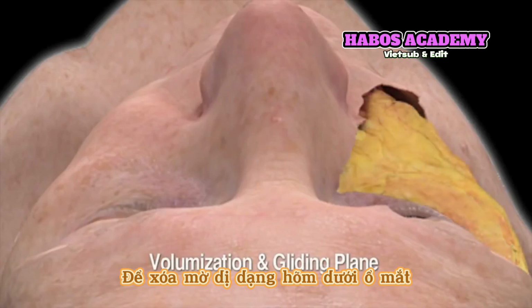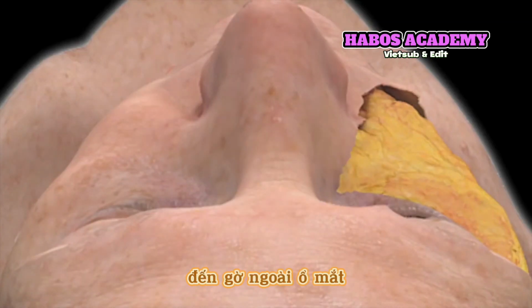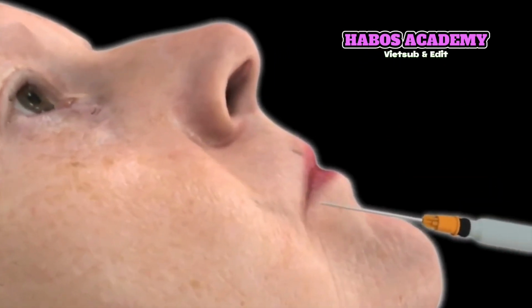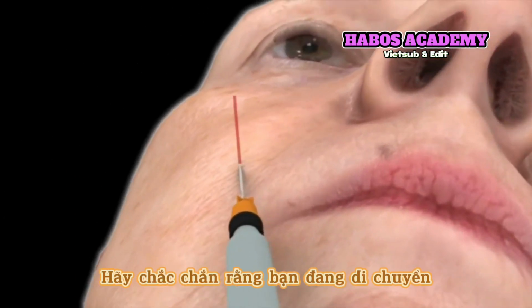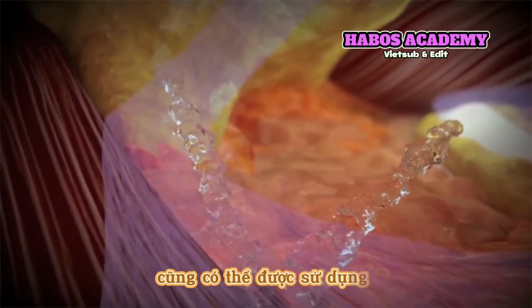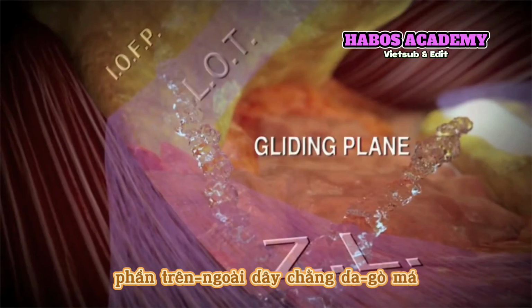Effective effacement of the V deformity requires volumization targeted between the mid-pupillary line and lateral orbital rim. This technique is performed through the nasolabial insertion port. A pinch and pull of the cheek in line with the lateral canthus will ensure passage within the prezygomatic space medially. A lateral vector in a superficial plane can be used for a calculated fill cephalic and lateral to the zygomatico-cutaneous ligaments.